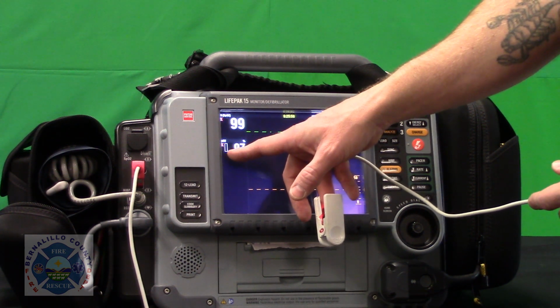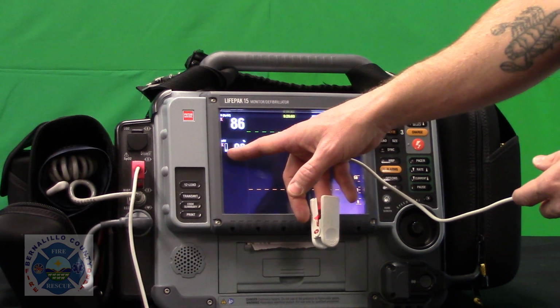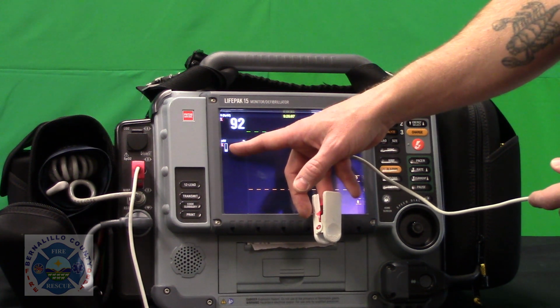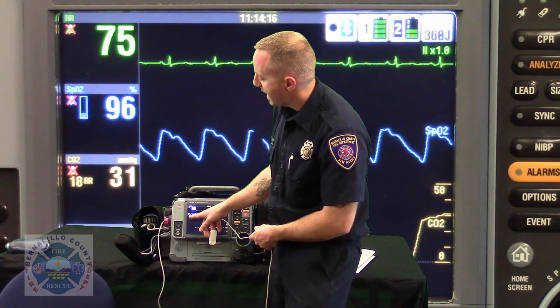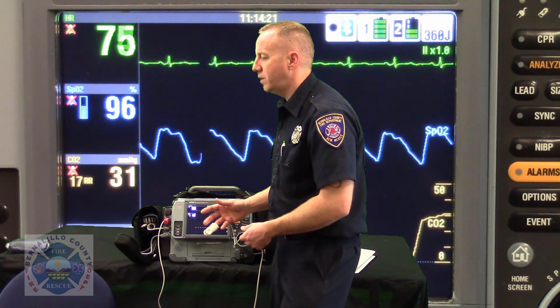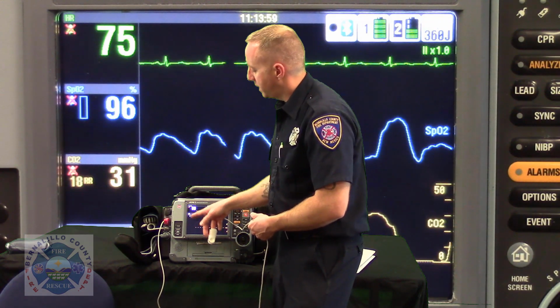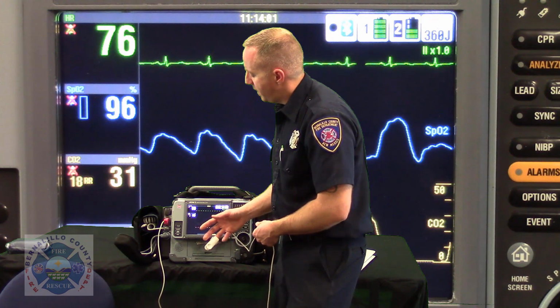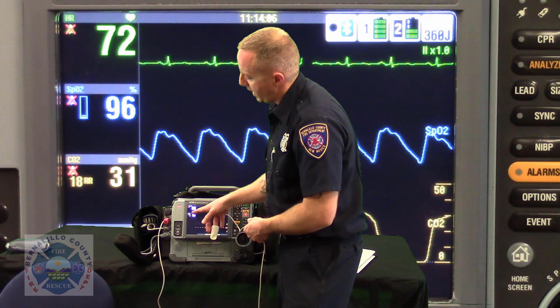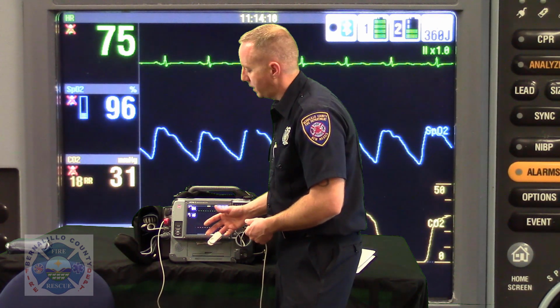And you'll see the pulsatile pulsations of the capillary level, where you're actually getting mechanical heartbeats through the capillary bed, and the height of this graph right here is a wonderful indication of how reliable your number is, because you could say, well, look at that, that graph is bouncing at least halfway, if not higher, in its whole range. So I'm pretty confident that the number I'm seeing there is probably accurate.